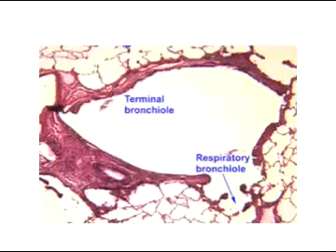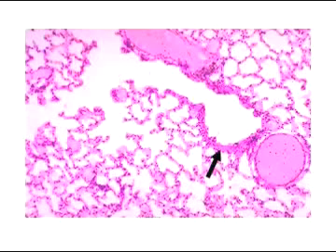For a bronchiole, there is no hyaline cartilage. In fact, it's been replaced entirely by smooth muscle. Occasionally you will see that the cuboidal epithelium of the bronchiole is disrupted with an alveolus, and because that alveolus is capable of gas exchange, we designate that particular area a respiratory bronchiole. Here is a really good example of a terminal bronchiole indicated by the black arrow, basically branching into the alveolar ducts and sacs. So you can see there's quite a difference between the thickness of the epithelium of the bronchiole, which should be cuboidal, and the alveolar ducts and sacs.